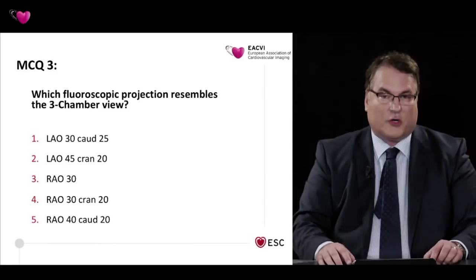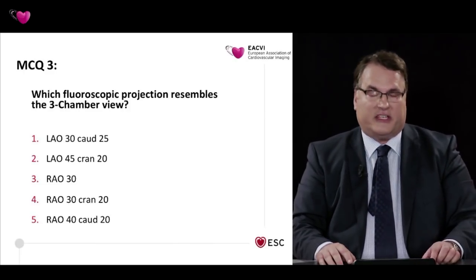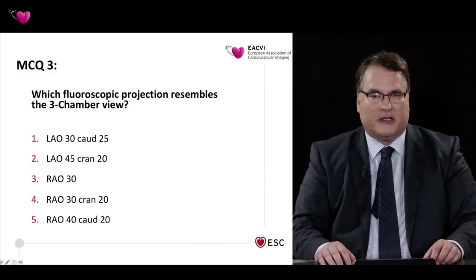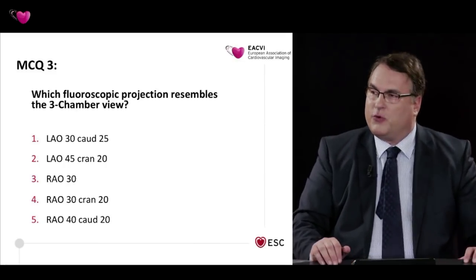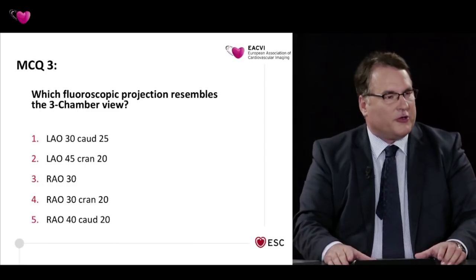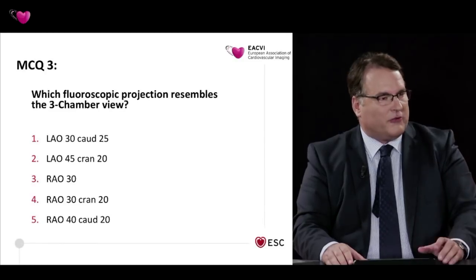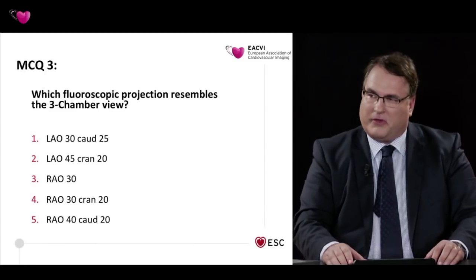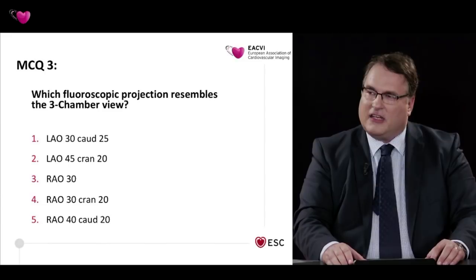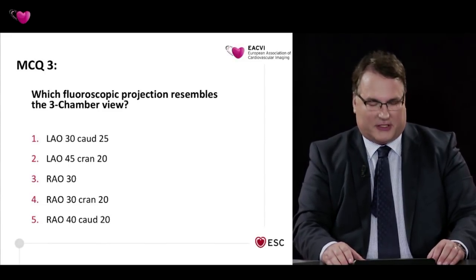So now the vote is open for the viewers of this webinar. We have 50 seconds open, and I think this is a very important question because when we came from coronary angios and LV angios, actually the answer there would already be given. But it will be very interesting to see what we really see in all those different angulations.